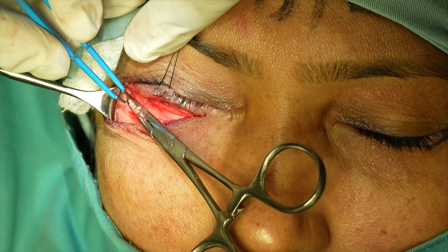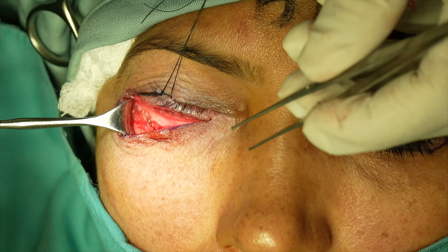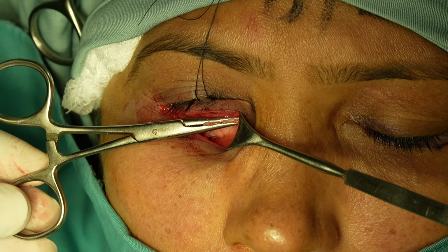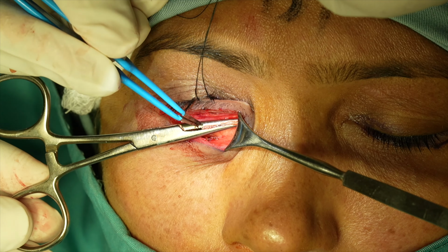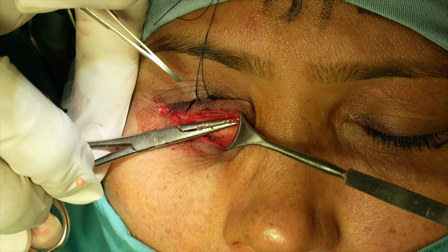Hemostasis is achieved with cautery prior to releasing the pedicle. Care is taken throughout to identify and preserve the inferior oblique muscle between the medial and the central fat pads.